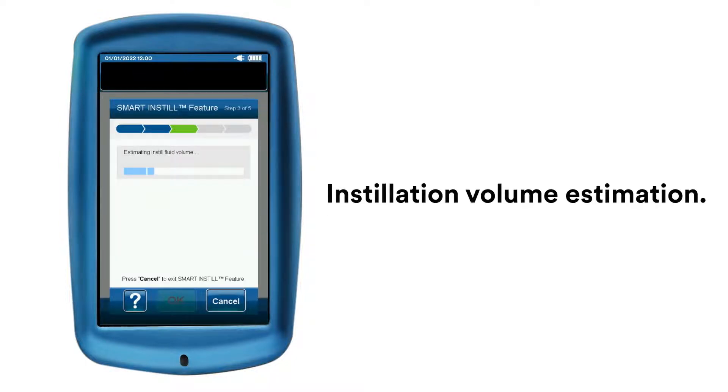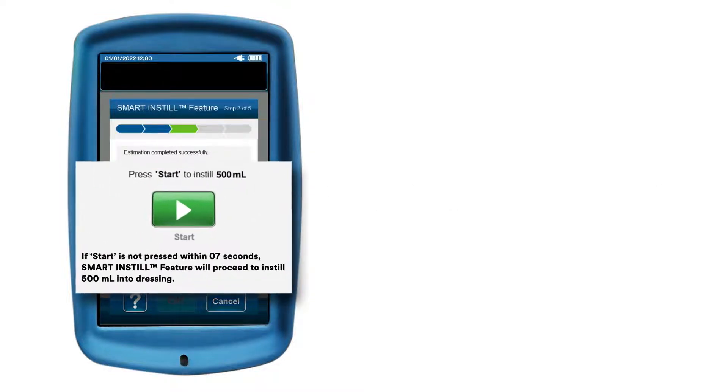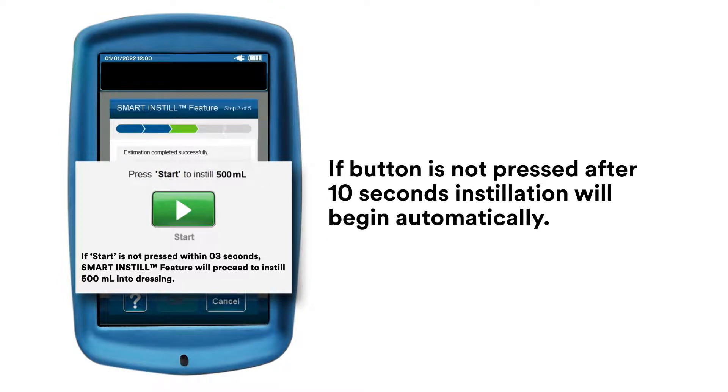As fluid volume estimation begins, you can easily track the progression of the Smart Instill feature. When estimation is complete, you may press the Start button. If the button is not pressed, after 10 seconds, instillation will begin automatically.